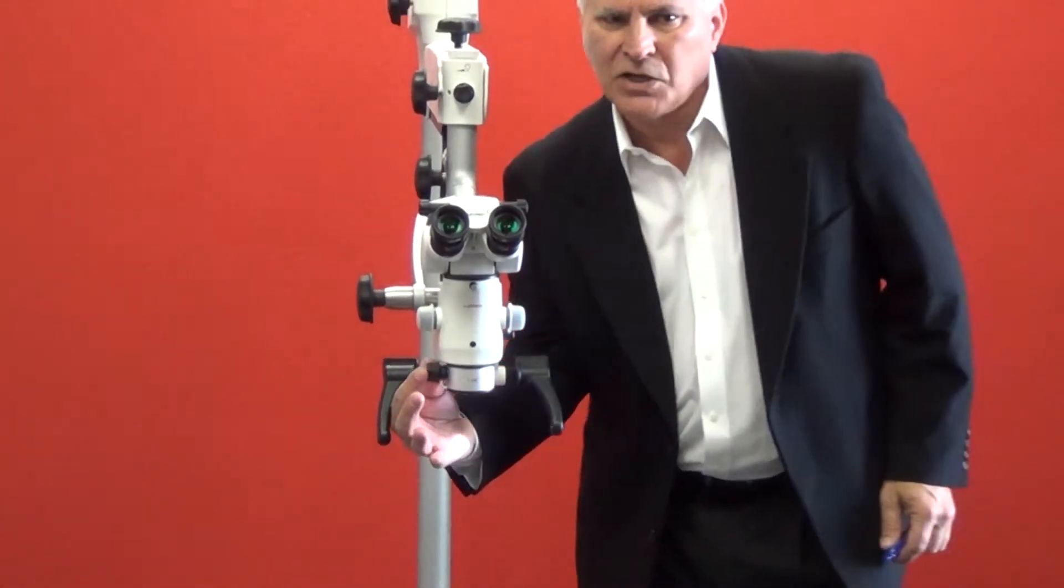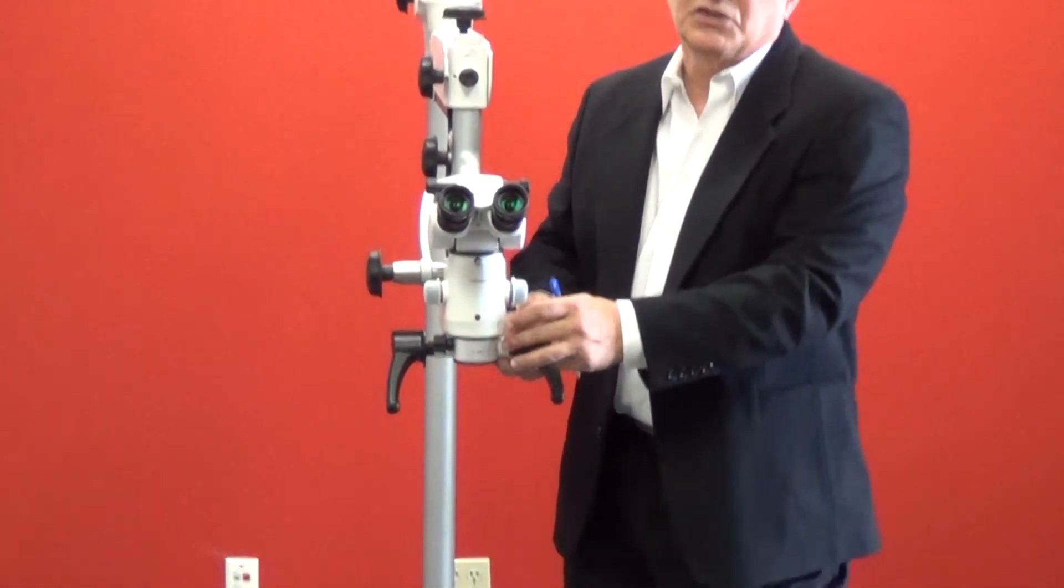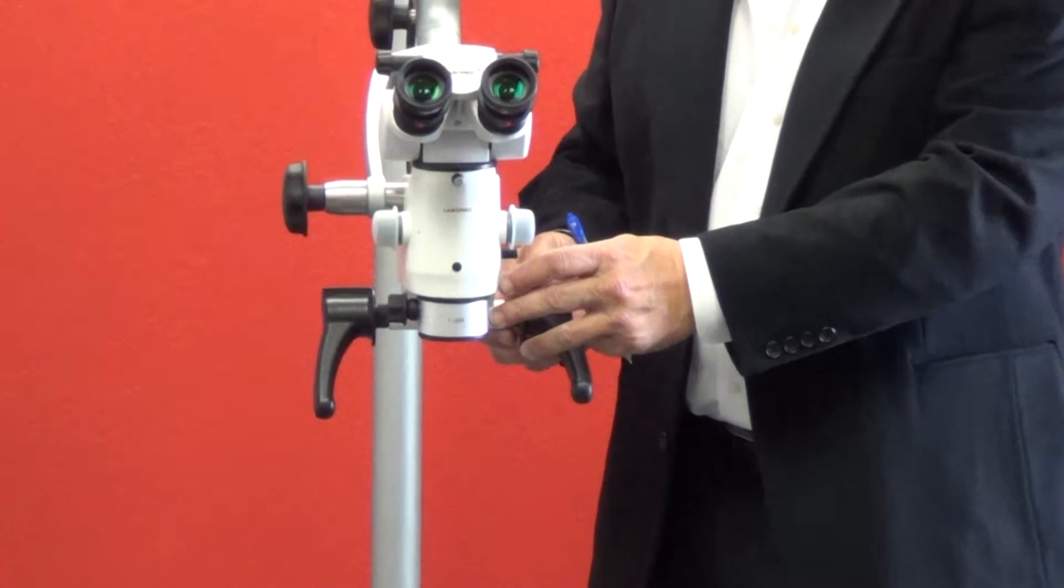The CMO also has a fine focus control. The position of this control can be changed for left-handed or right-handed use.